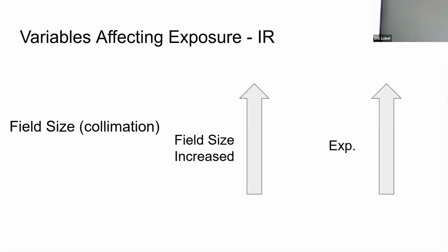But with more kV, you've lost some energy knocking out that electron. The photon changes its angle and can come out of the patient carrying the wrong information. That's scatter that shows up as noise. So that's how increases in kV increase scatter, because they increase literally the energy of photons.